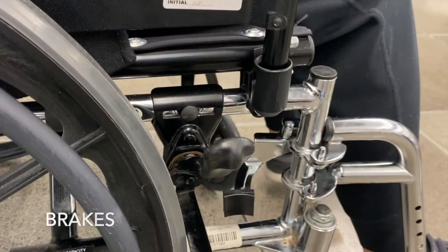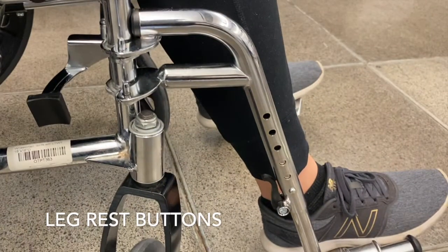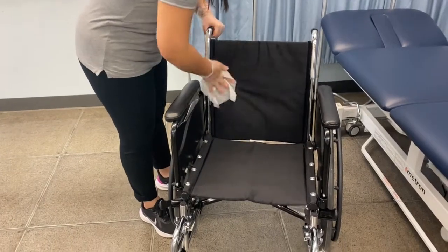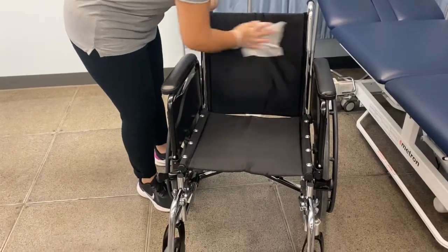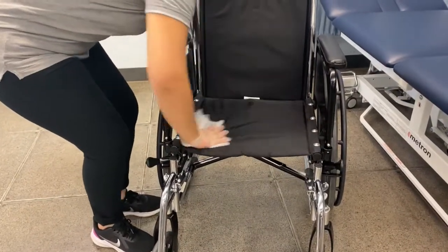The brakes of the wheelchair are often touched by the patient and healthcare provider, and the leg rest buttons are often touched by the healthcare provider to adjust the height of the leg rest. The seat and the back of the wheelchair will also need to be disinfected because they are in contact with the patient's body and can contribute to the spread of infection.